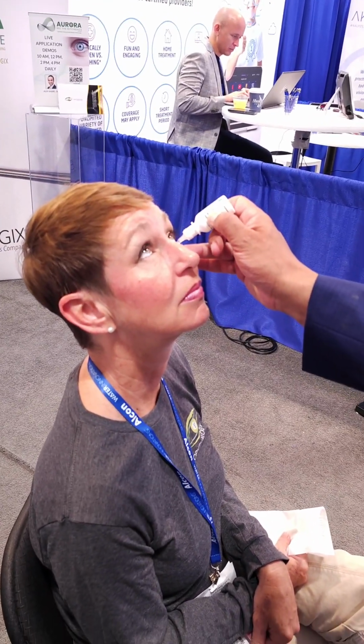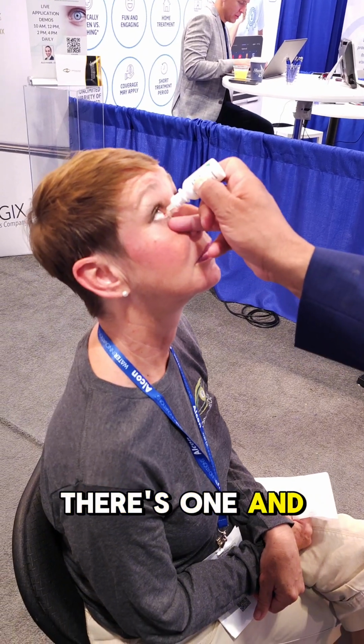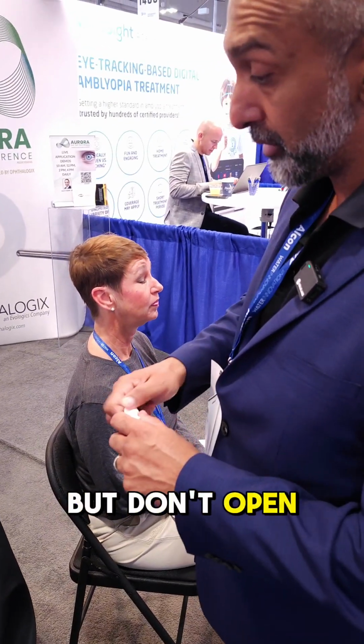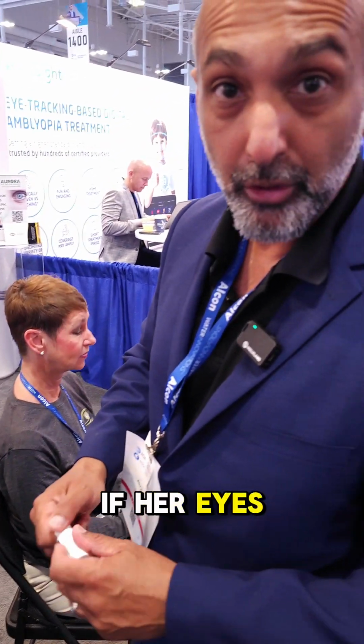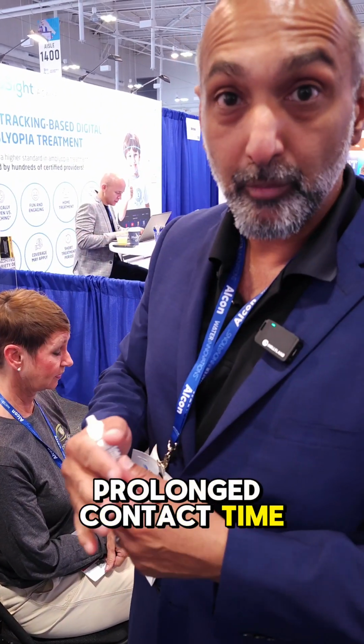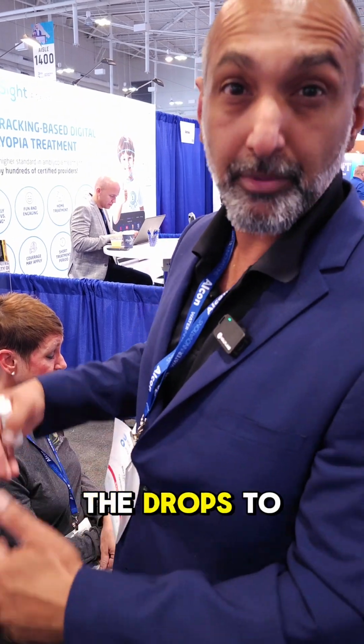Good. There's one and two. She'll gently close for about 30 seconds. You can dry your eyes if you like, but don't open for about 30 seconds. Of course, if her eyes are closed, she's not blinking. If she's not blinking, the drops are staying there. Prolonged contact time with the corneal surface, enough time for the drops to take maximal effect.